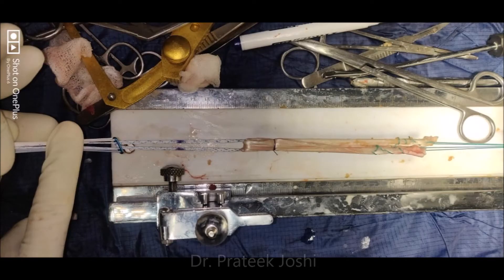Here we have passed the graft, which we prepared from hamstring, through the adjustable loop. The marking on the adjustable loop has been done at 35 millimeter distance from the button, which corresponds to our femoral tunnel. The marking on the graft has been done at 20 millimeter distance, which corresponds to the desired length of the graft to be kept in the femoral tunnel.